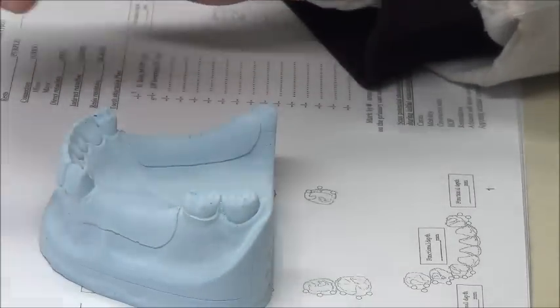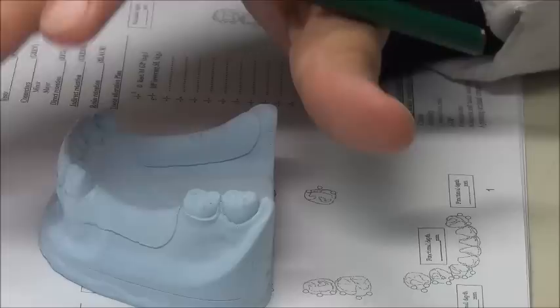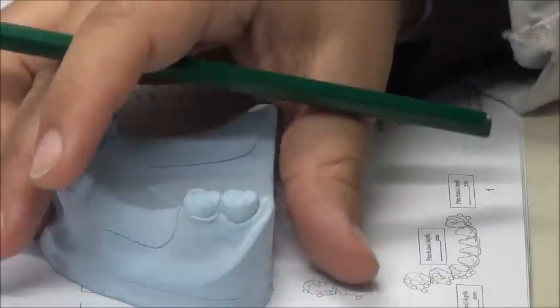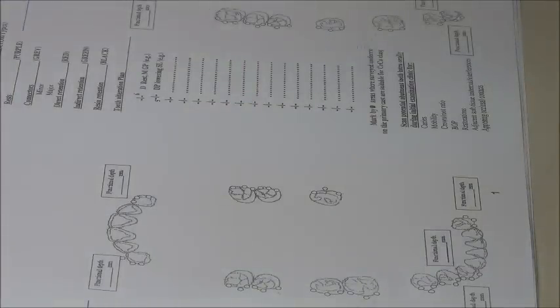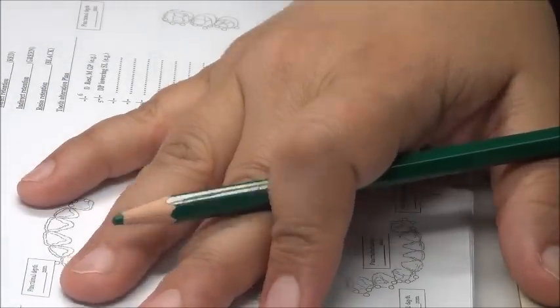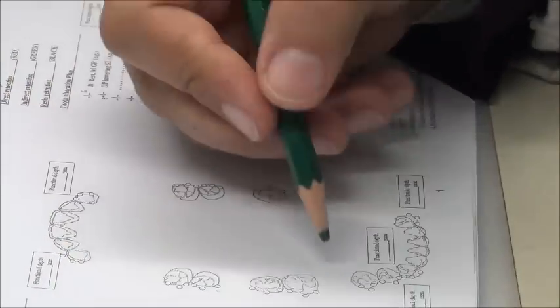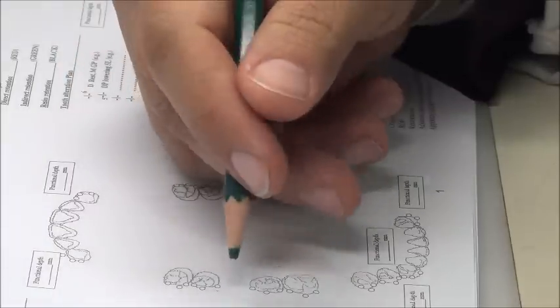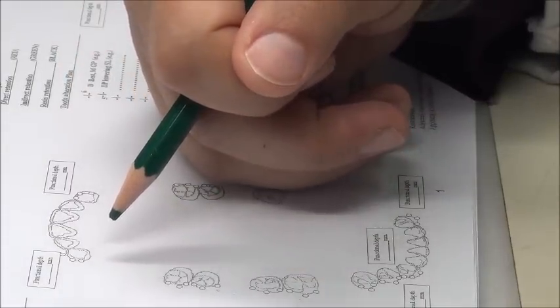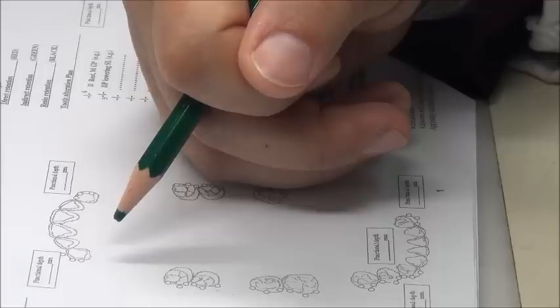Now, in the cases we have designed, we have not followed even the simplest design. I'm going to talk first about the simplest design, and then how we change it. So we have a bounded saddle, any bounded saddle, in the lower left area, page 3 of the design paper.